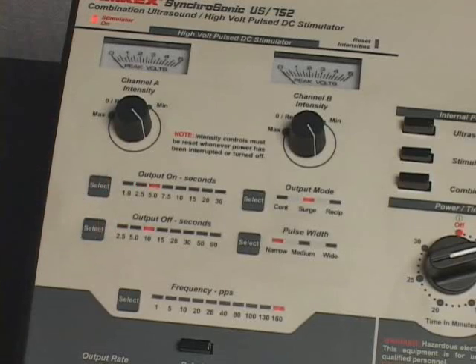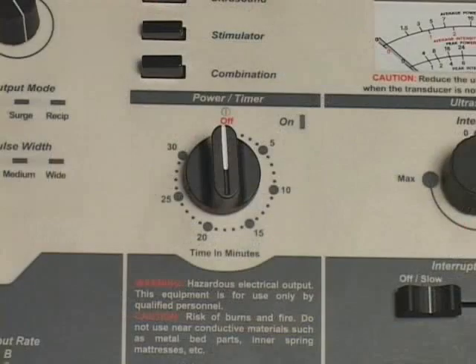Press and release the Output Off control to select an Output Off duration for the surge mode. The Output Off indicator light array will indicate the output off duration selected. The Output indicator lights for Channel A and Channel B will reflect the surge off duration selected. The Output Off control is disabled in the continuous and reciprocal modes. When treatment is completed, stimulator output will be discontinued immediately. The Power Timer switch shuts off and a bell sounds. The Output Intensities reduce to zero as indicated on the Channel A and Channel B intensity meters, and the indicator lights do not illuminate.